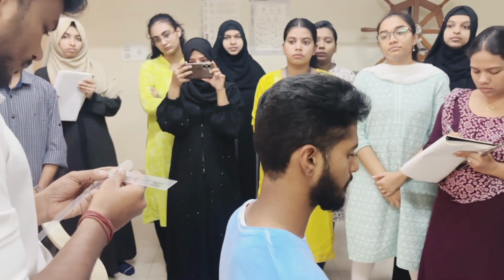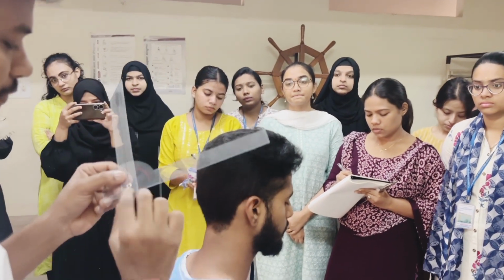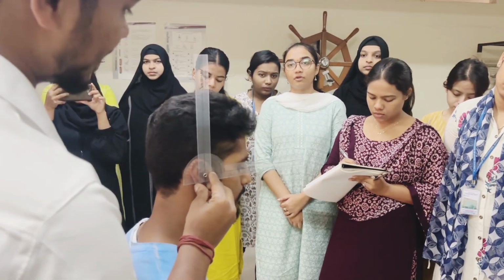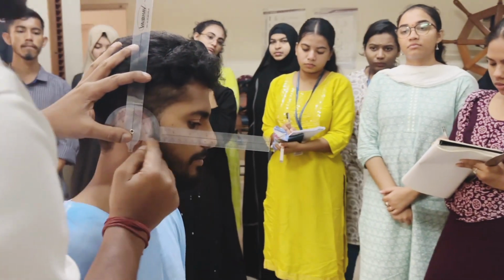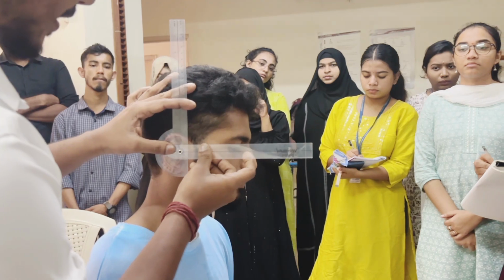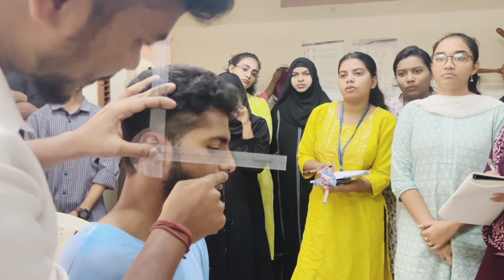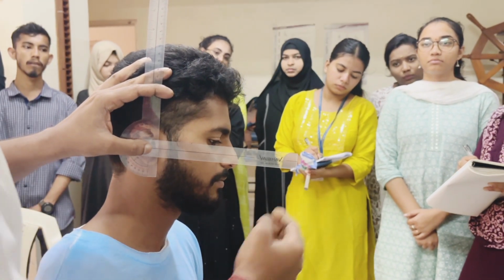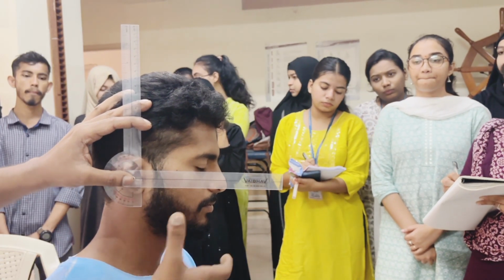Here I am taking it into the 90-90 degree position. The fulcrum will be over the external auditory meatus. The movable arm will be exactly at the base of the nose. The stable arm is perpendicular to the ground.